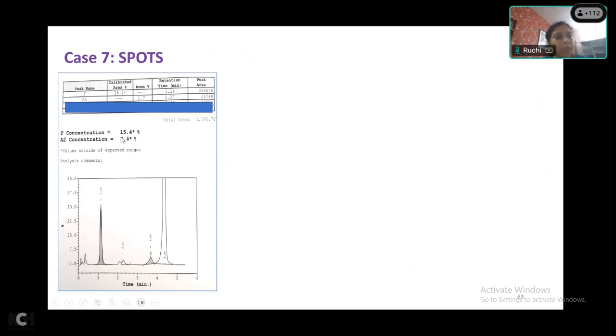Here we have a case where HPLC-F is 15% and A2 is 3.4%. Then there is a peak of almost 70-80% after A2 at a retention time of 4.3. So diagnosis, Diljot? Because retention time is 4 point, I mean it's after the A2 peak, it can be HBQ. For HBQ the percentage is not abnormal, 70-80% will not be HBQ. HBQ is a beta thalassemia variant or an alpha thalassemia variant? Okay, never mind.